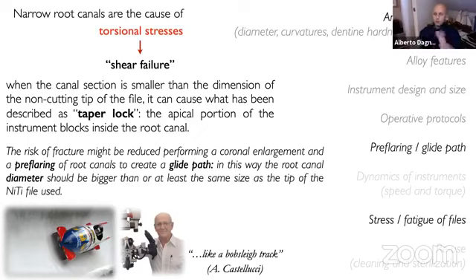We have only to direct it inside the root canal without pushing it, without stressing it, making it free to reach the working length. And that's why we have to create every time an adequate pre-flaring, pre-enlargement of the canal to avoid the blockage of the tip of the file.